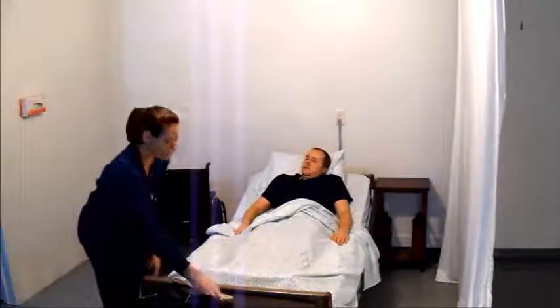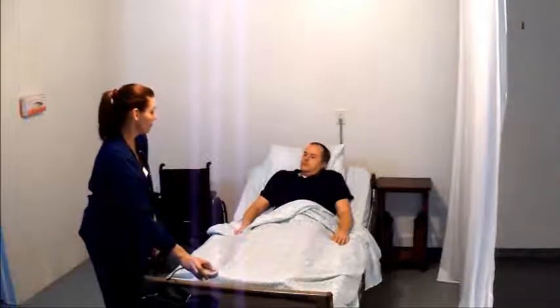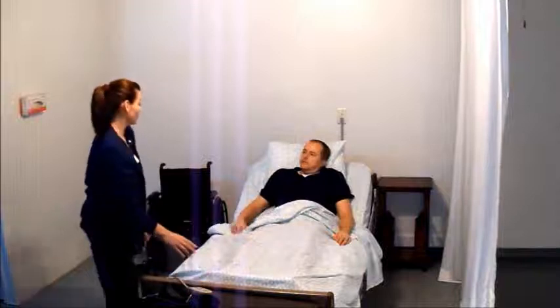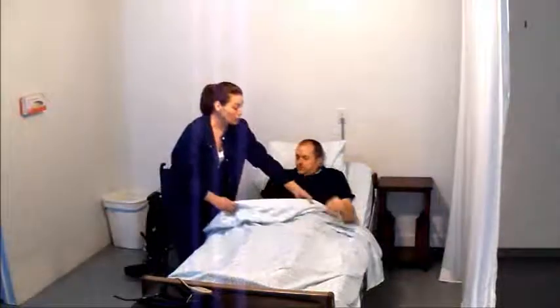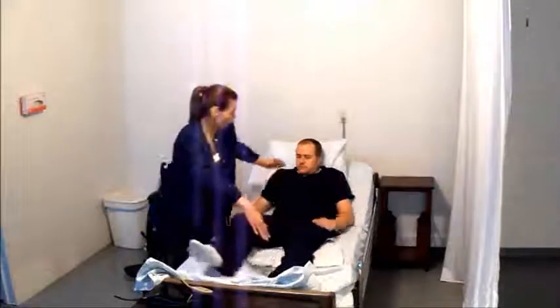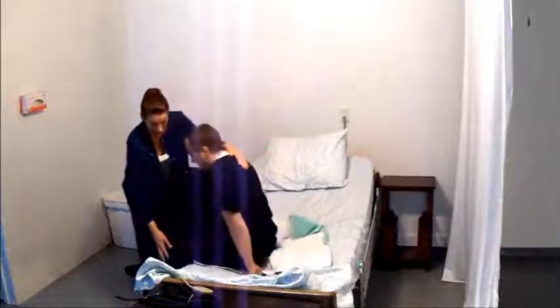Lock the wheelchair before standing the resident to begin the transfer. Apply the transfer gait belt before standing the resident, placing it around the resident's waist and over clothing, secured so that only flat fingers or a hand fit under the belt and the belt does not catch skin or skin folds.